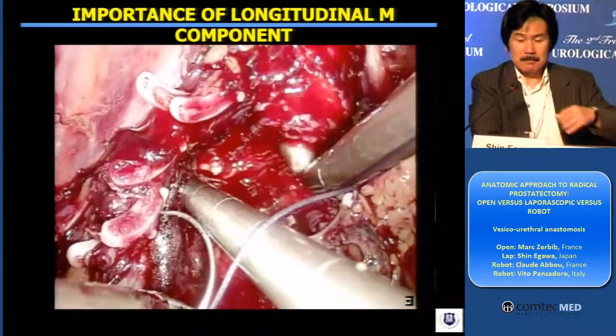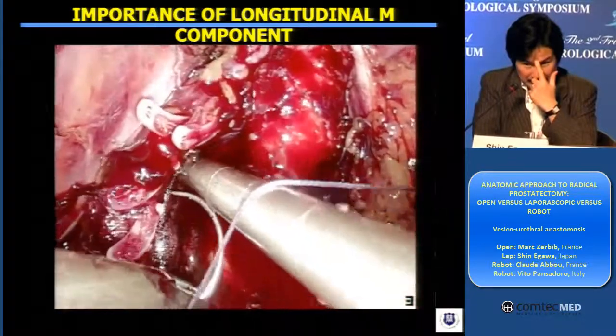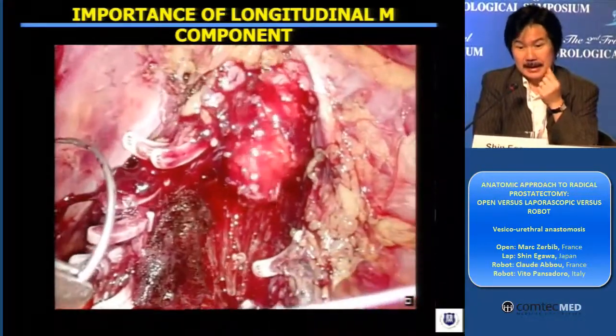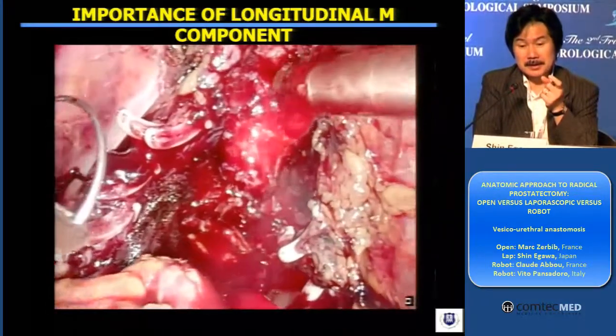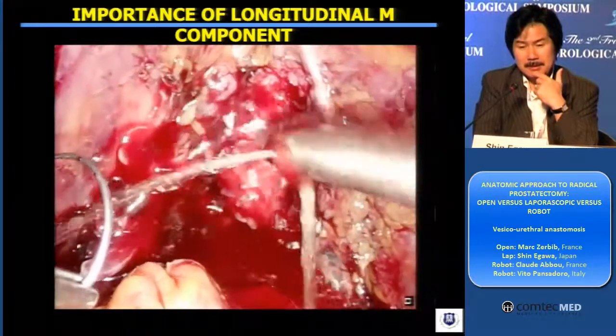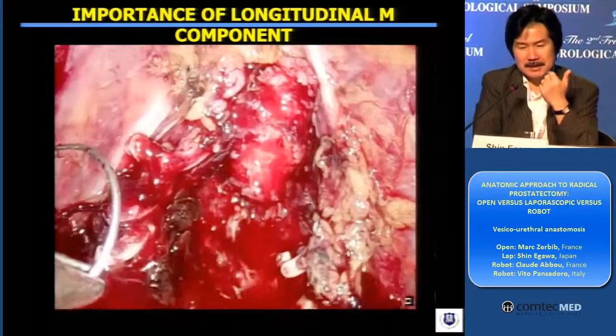The result is here. And you see the urethra stump here, like a pencil tip shaped. And you see the longitudinal portion of the longitudinal smooth muscle very clearly, and that makes it much easier for us to suture.